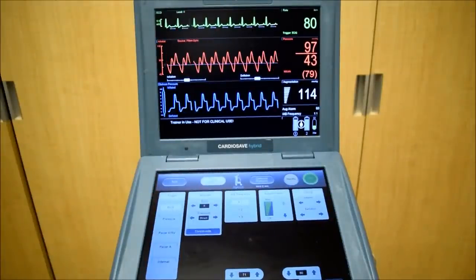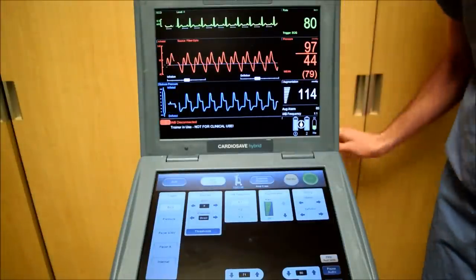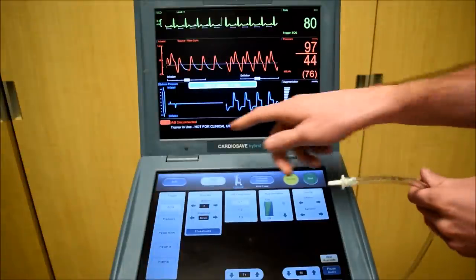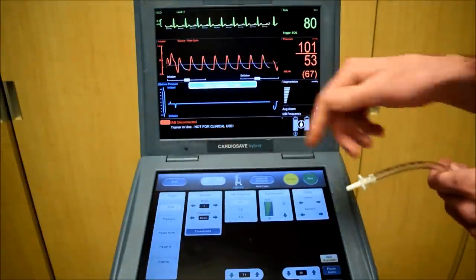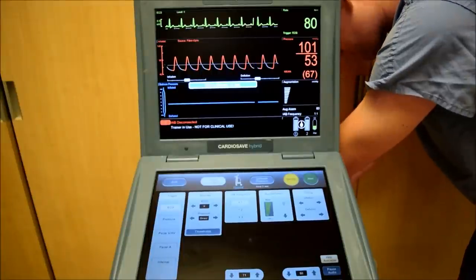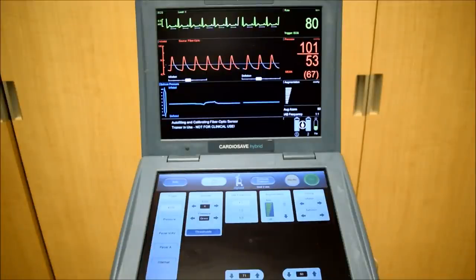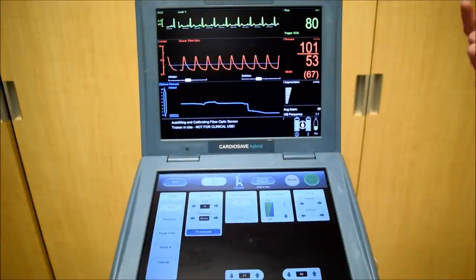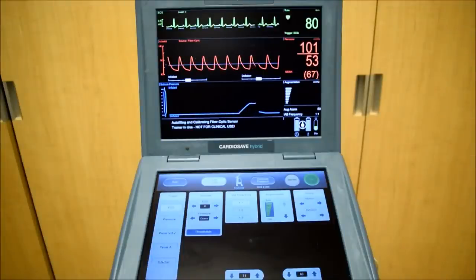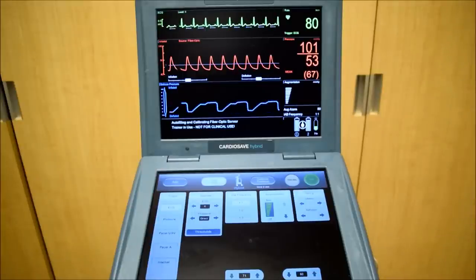Another alarm you may encounter is if the balloon becomes unconnected. An alarm appears: balloon pump disconnected. Reconnect the balloon and restart it. After you restart it, it will need to go through its calibration sequence again. Once it goes through the calibration sequence, it will start up again.